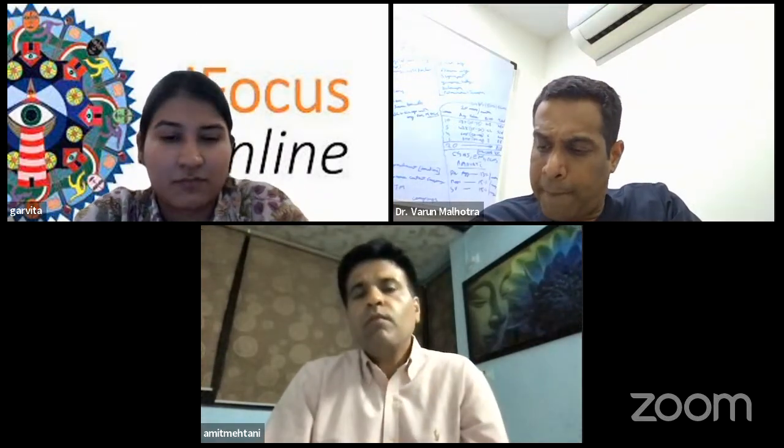Okay, and another thing, Abhilasha, you clearly mentioned that you obviously do not attempt multifocals in uveitic cataracts. I think it's fair, but do you have any experience with EDOF lenses like Vivity? Do you use them in uveitic cataracts, and what has been your experience? I try to avoid all such lenses which will reduce the contrast by even a very small percentage, because these are already compromised eyes.